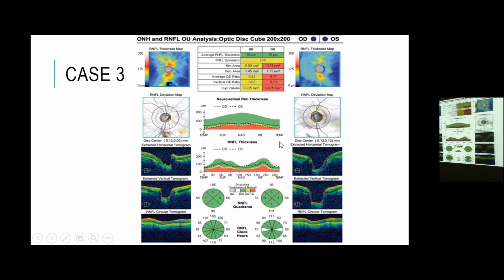Yeah. Okay. Also was mentioned this. Okay. Also there. In the deviation map, also there is borderline. Going to the thickness of the nerve fiber layer, it doesn't show anything. Over in the clock hours in the template shows a band. Is it defective? This one. Yes. The band.